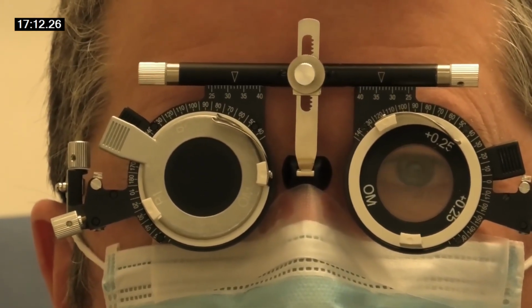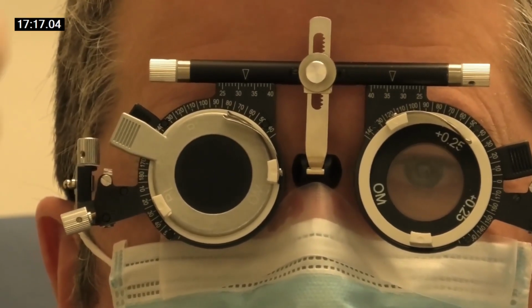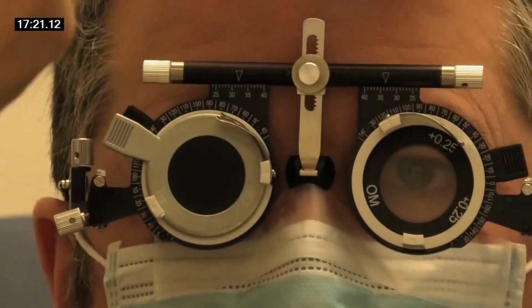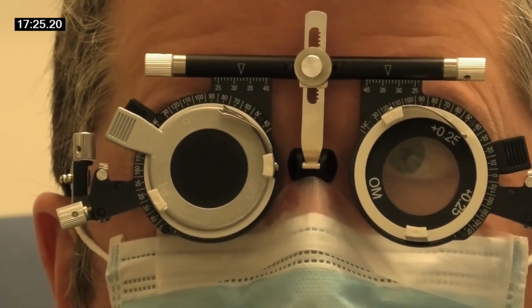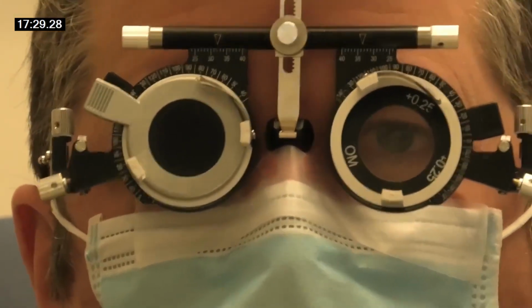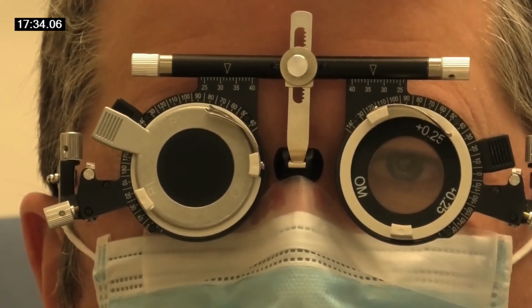There you go. That flip, you have to practice it at home. Because you can see, it's quite tricky to get the spin. Then you wait for a little bit, and then you spin it again. It's got to be really quick, so they get one after the other very quickly. That is actually quite tricky to do. It takes a while to get the hang of it.